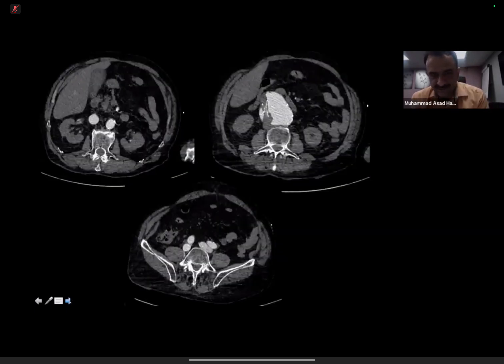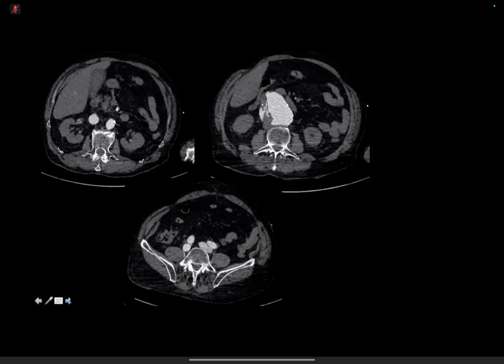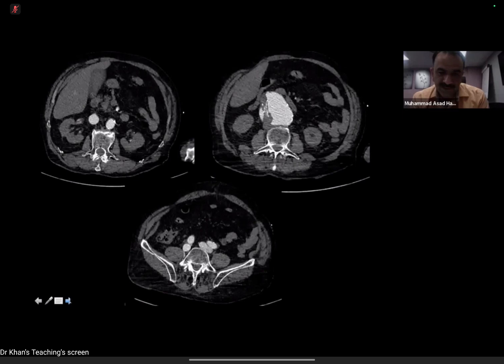This is the patient, as you can see on these images. The examiners can show you these images as well, where you can see the aorta is basically ulcerating into the IVC and the contrast is going into the IVC. Also, as you can see, the contrast density is similar in the iliac arteries and veins. So this is the high pressure contrast going from the aorta into the venous system and showing an aortocaval fistula. Now, are you aware of any other causes of having similar contrast density between aorta and IVC, especially along the upper abdomen?